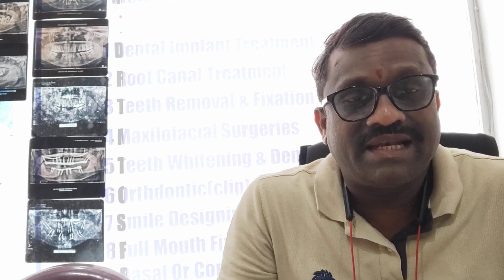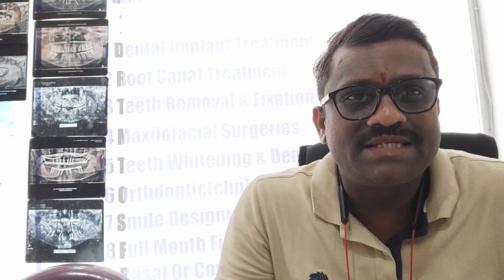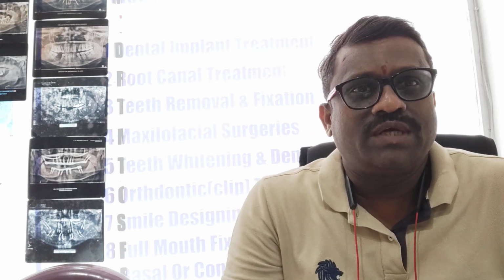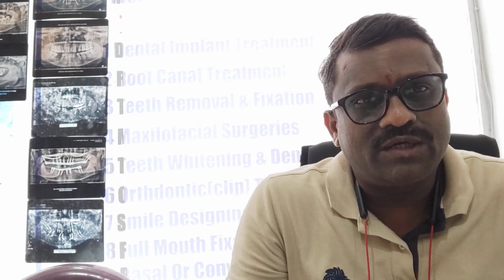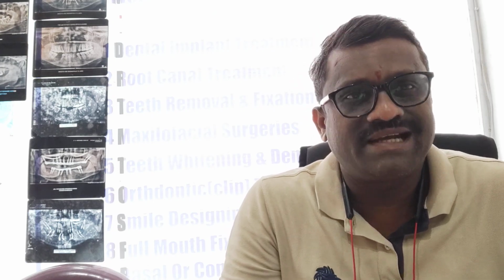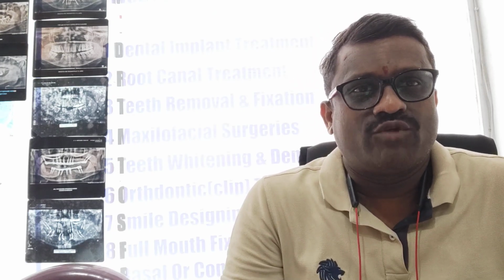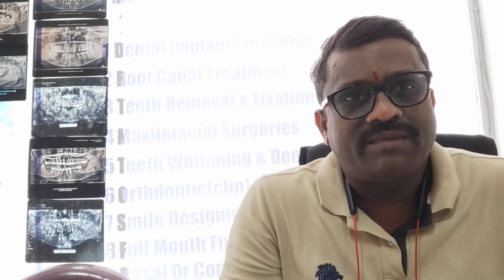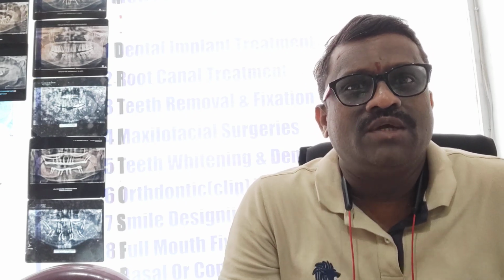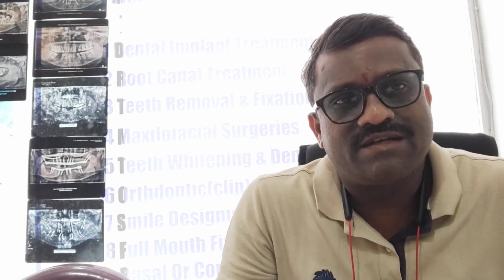Suppose we plan 21 or 23, first we go with the pilot drill. Depending upon the type of bone, you will get to know while doing the osteotomy. After the pilot drill only, you will place the implant of desired length, maybe 4.5 by 20 or 5.5 by 23. You should decide which length you want to place to perforate the nasal floor.